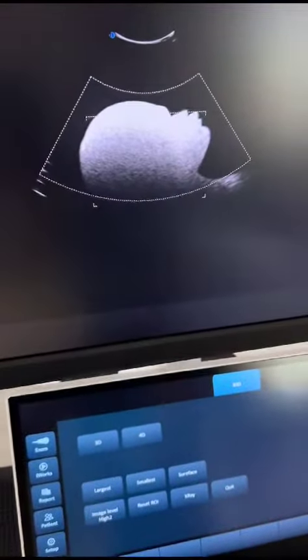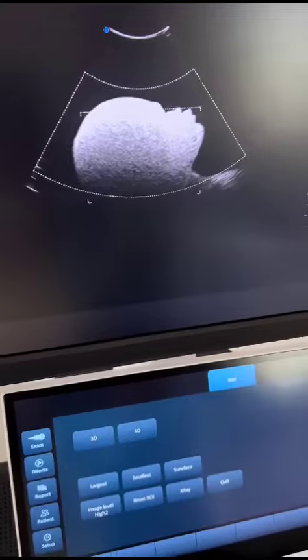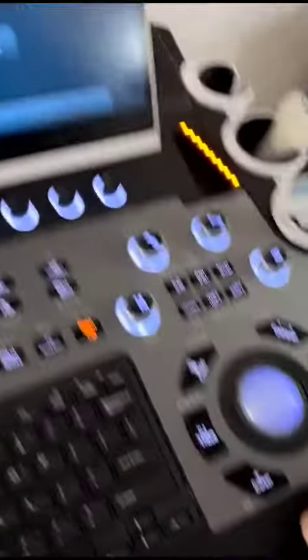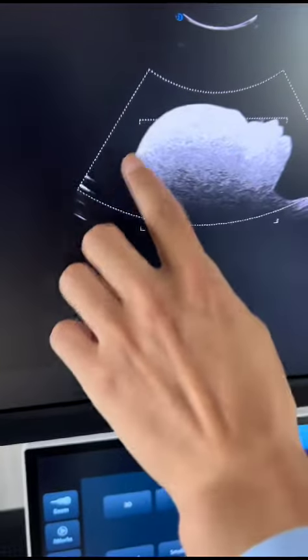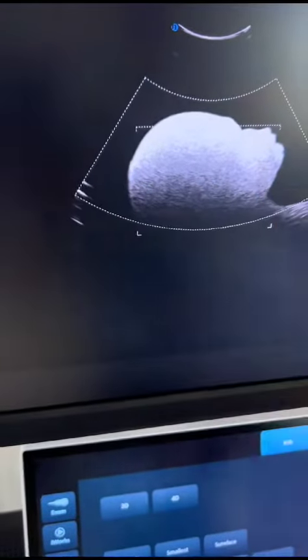Then press this key again to make this sample line, to put the baby's face under the sample line, like this.